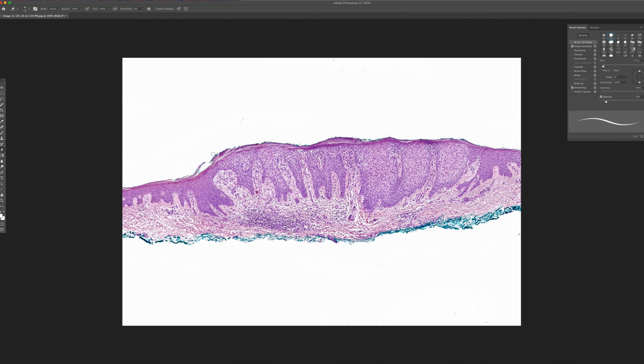Now, there are several things we need to notice. When you start playing around with shadows and with contrast, you'll find that bits of dirt that weren't obvious when you started suddenly become apparent.